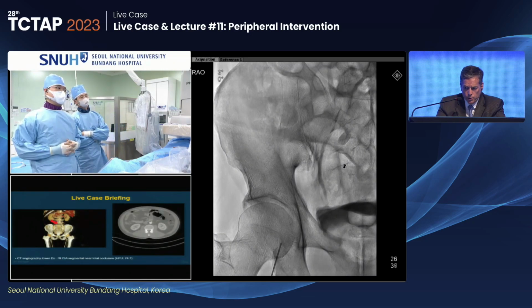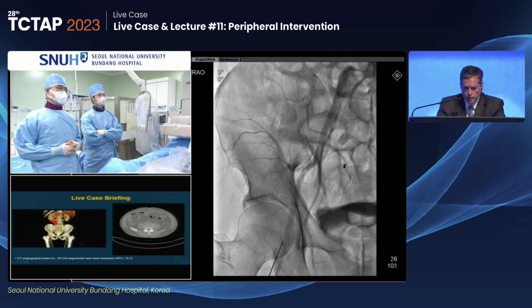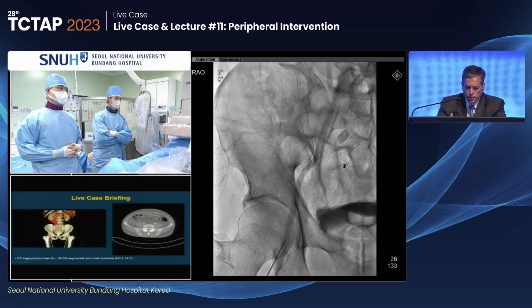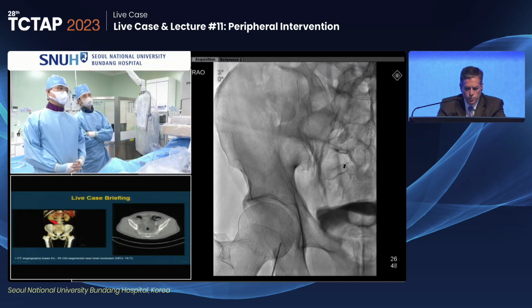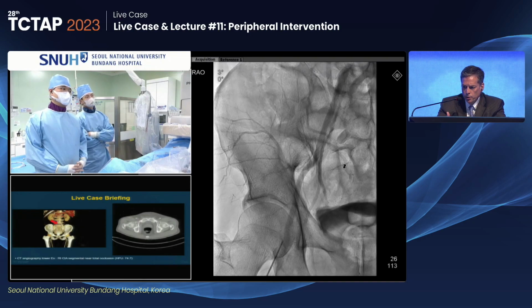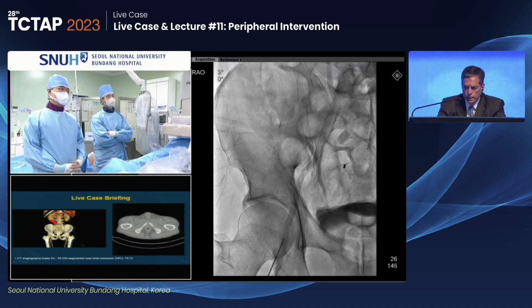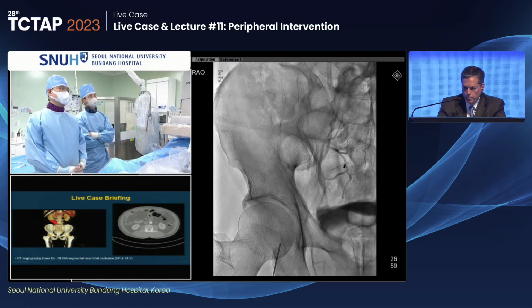And so to progress there, as Dr. Laird was saying, it becomes a big challenge that you could make things a lot worse. So the challenge now with the retrograde is that you need to be able to enter centrally. If this goes awry, then I guess the options are going to be kind of a rendezvous technique without creating much of a bigger complication.